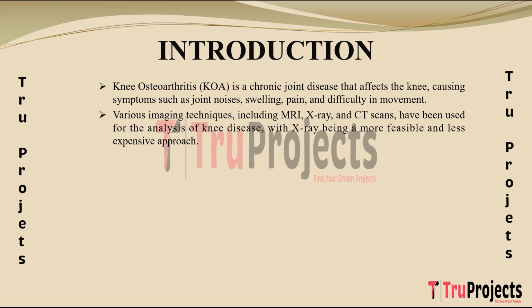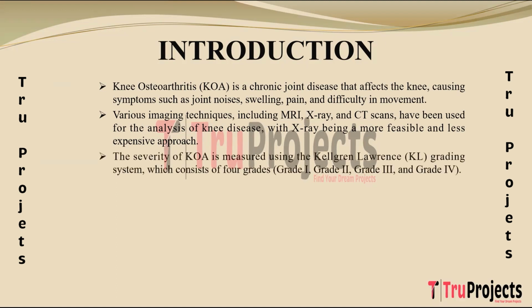radiation exposure. The Kellgren-Lawrence grading system is a radiological classification used to assess the severity of KOA, knee osteoarthritis, based on X-ray findings. It categorizes the disease into 4 grades: grade 1, grade 2, grade 3, and grade 4.